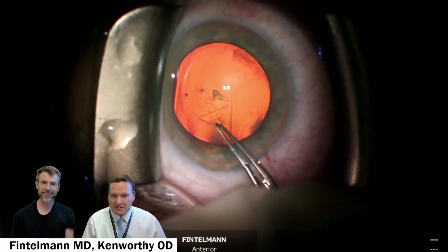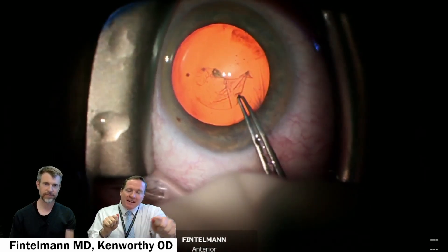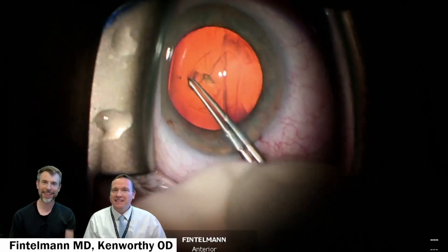Capsulorrhexis. One of my favorite parts to watch is this part, the capsulorexis. That red reflex and just seeing it peel off manually in almost a perfect circle as you're pulling that off of the front of the capsule. Hours of practice.